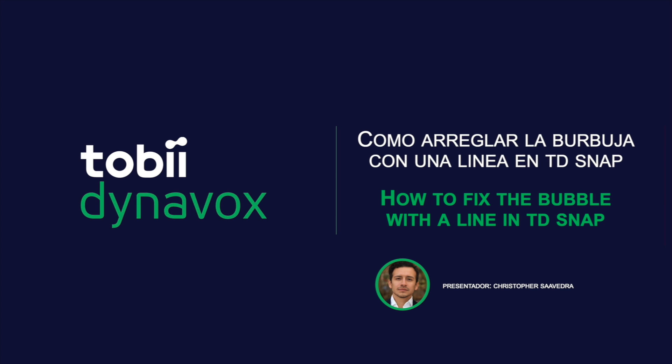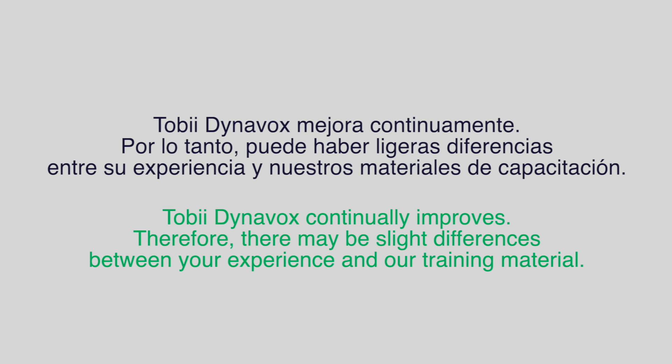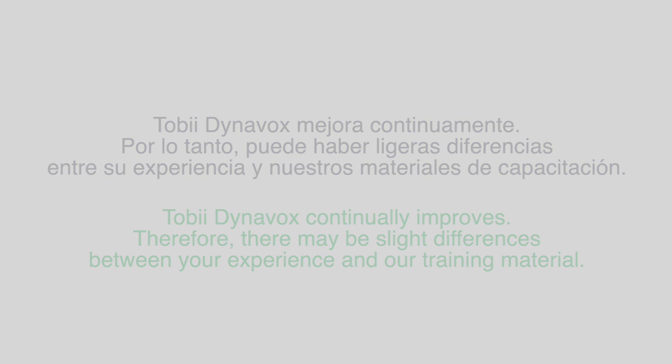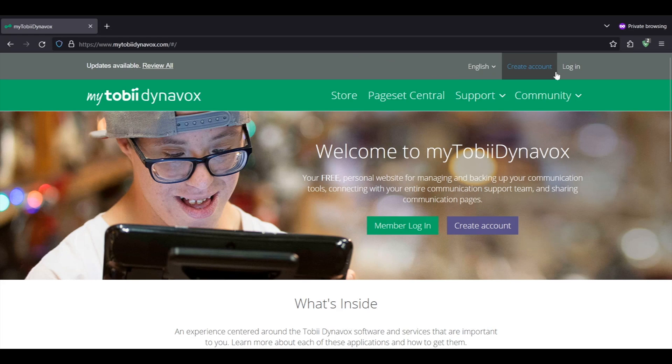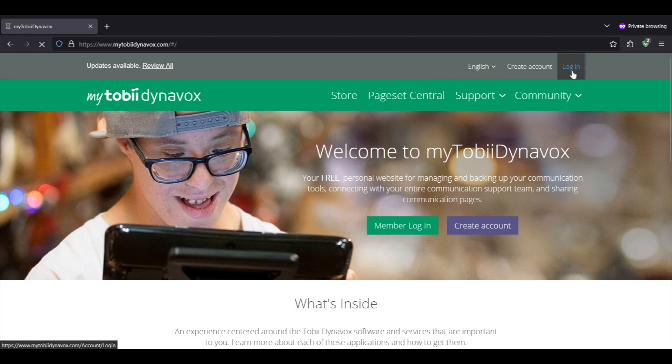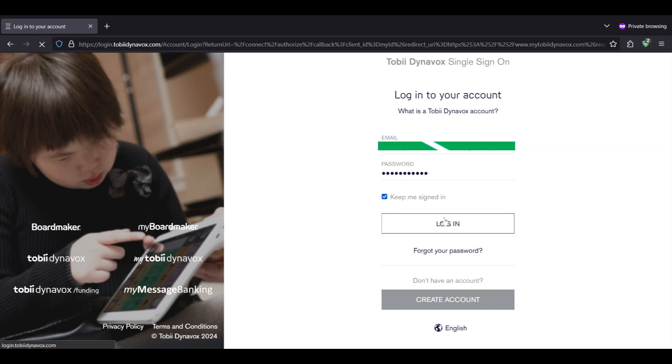How to fix the bubble with the line in TD Snap. Here we can see the bubble with a line through it. Let's go to mytobiidynavox.com and log in. Enter in your credentials.